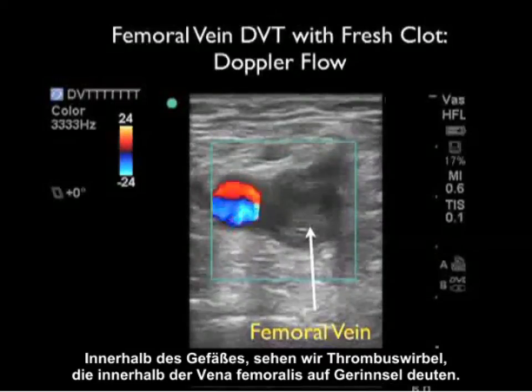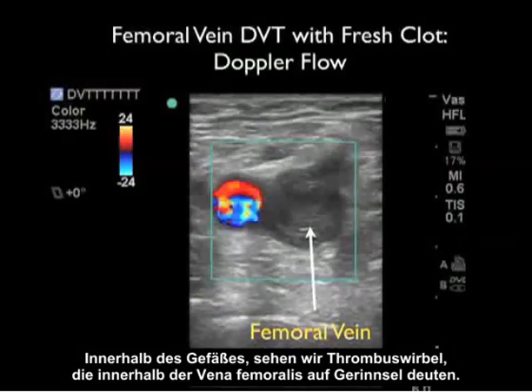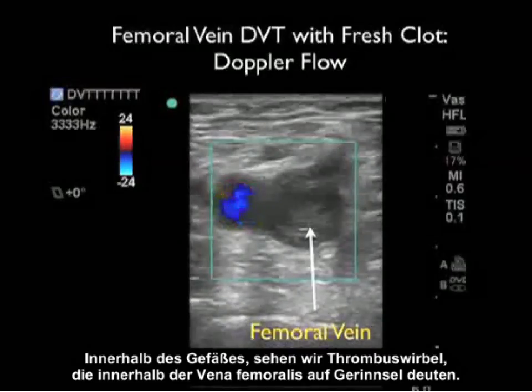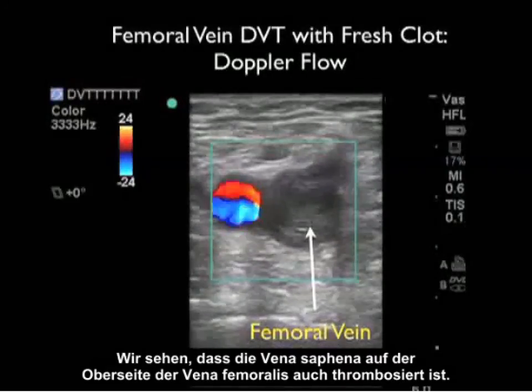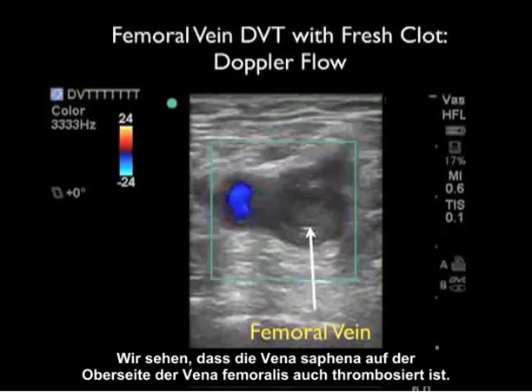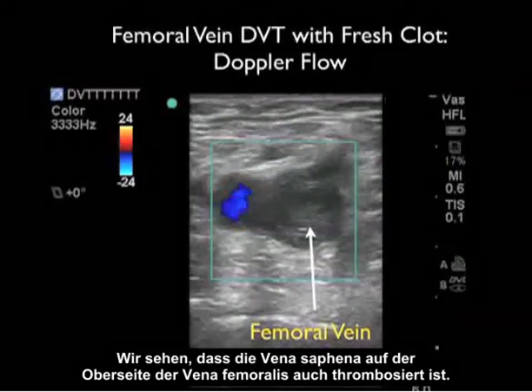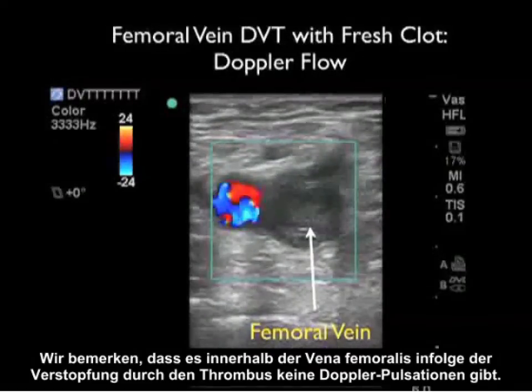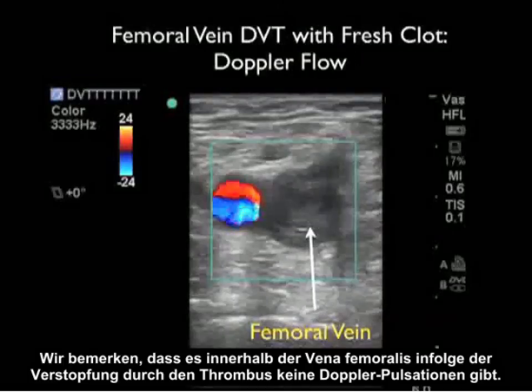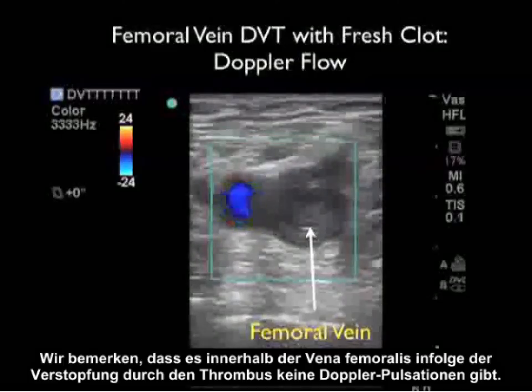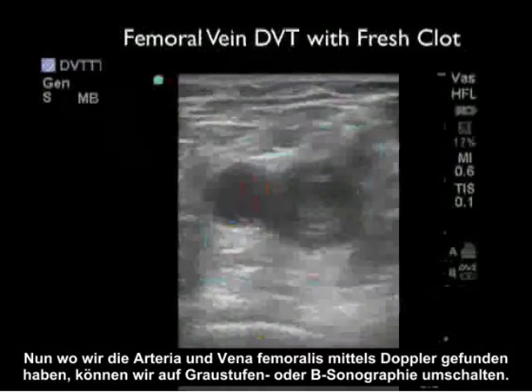Looking within the vessel, we can see swirls of thrombus within the femoral vein consistent with clot, and we note also the saphenous vein on top of the femoral vein is also thrombosed. We note here that there are no Doppler pulsations within the femoral vein as a result of blockage due to the clot.